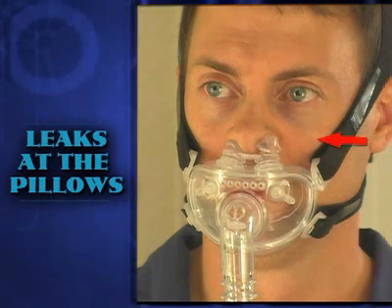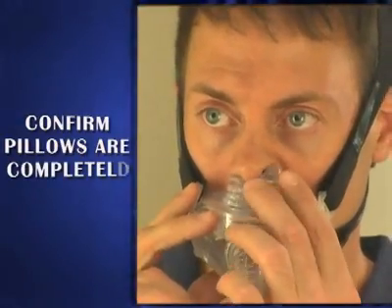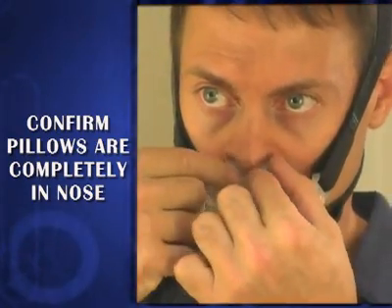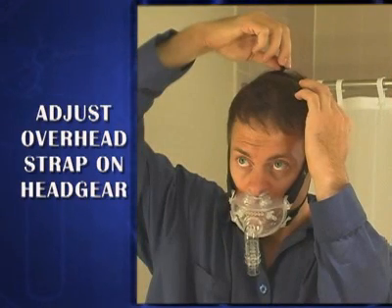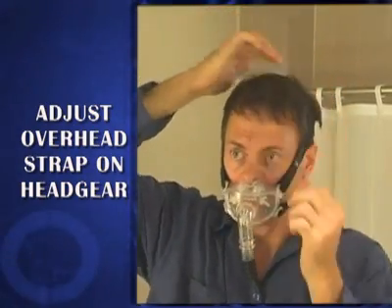If you are experiencing a small leak at the nasal pillows, confirm that the nasal pillows are completely seated inside the nose and on the rim of the nostril. Use your fingers to guide the pillows into the correct position. The over-the-head strap on the headgear can also be adjusted to modify the fit of the pillows against your nose.